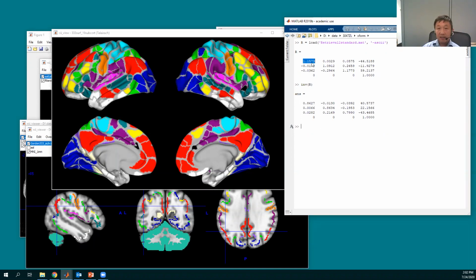But in this case, it's simply that the first dimension is flipped if this is a negative number. So if you see two transformation matrices that are not the same, be very cautious, because not only the sign differs, the image is flipped in the first dimension. I think that's mainly for FSL. For other packages, pretty much they all use right-handed.